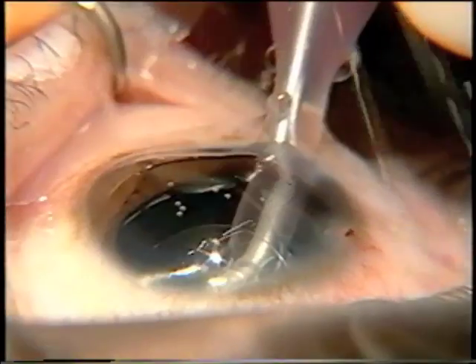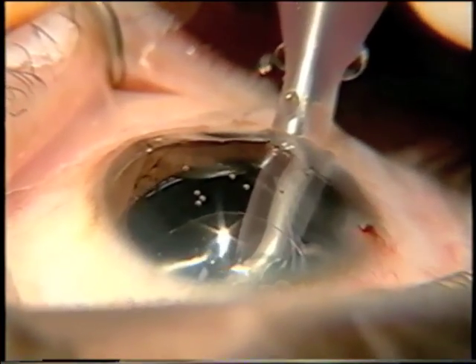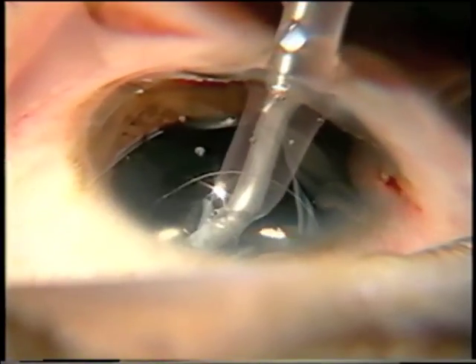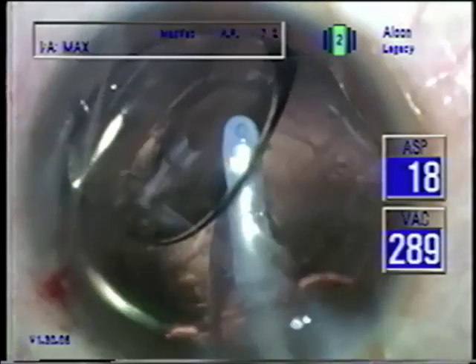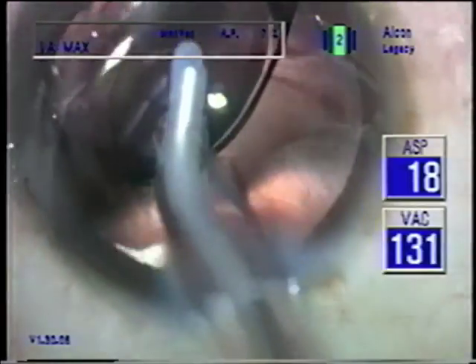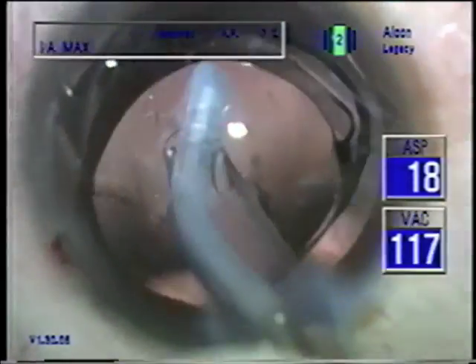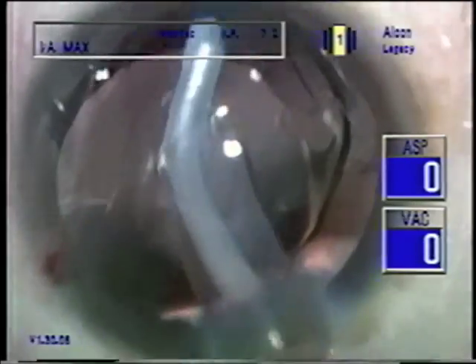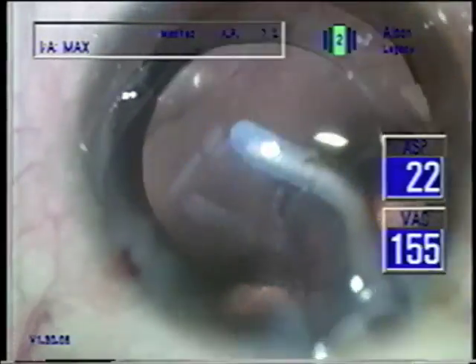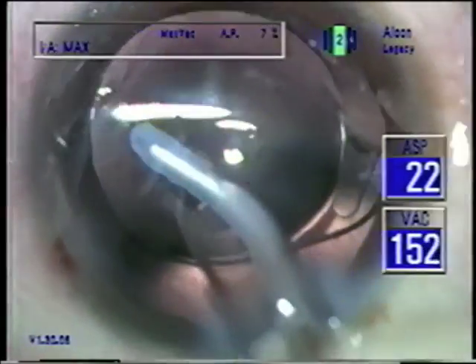I-A cap back, memory one, I-A max, memory one. The ProVis comes out easily because of its cohesiveness. I like to go under the IOL to get the viscoelastic out. Notice it's very easy to de-center this — just watch me push that, open up that loop a little. You can use the I-A tip to unfold the lens haptic too. It de-centers very nicely when you deliberately move it to facilitate your viscoelastic removal.